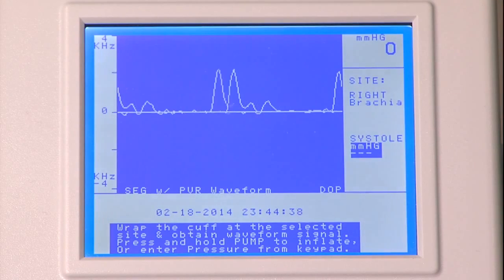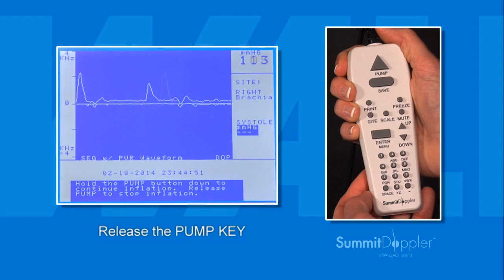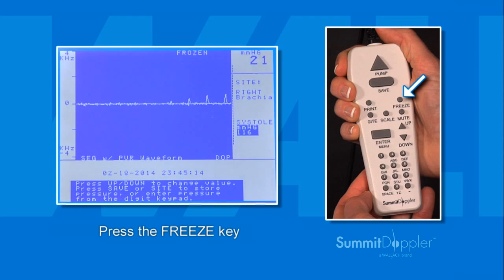Hold the probe in place and press and hold the pump key until pressure reaches approximately 20 mmHg above the occlusion pressure and blood flow is no longer audible. Once this occurs, release the pump key and the cuff will automatically begin to deflate. When the pulse returns and the arterial blood flow becomes audible again, press the freeze key on the keypad to freeze the image on the graphic waveform display. When you have determined the pressure is correct, press the save key.